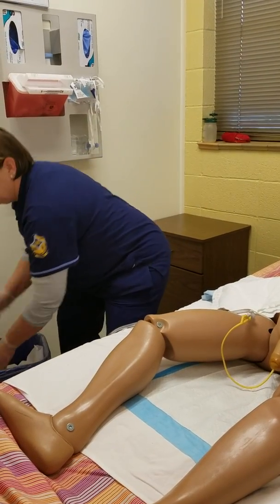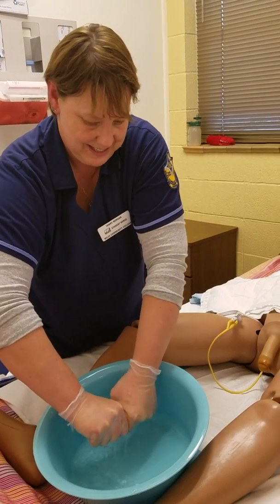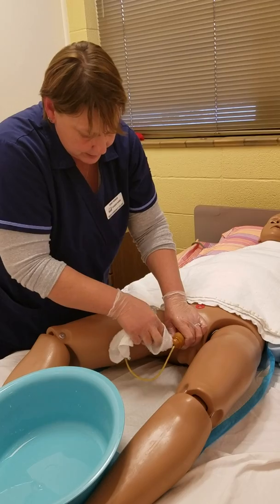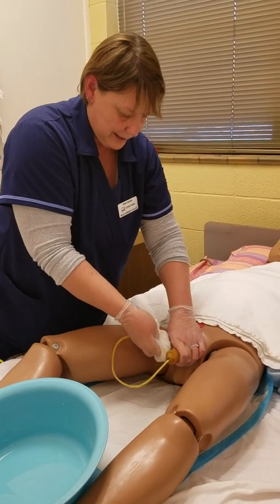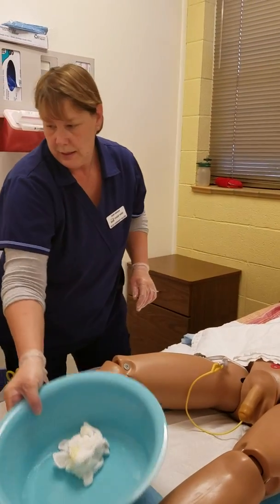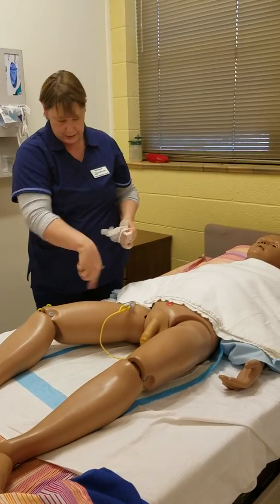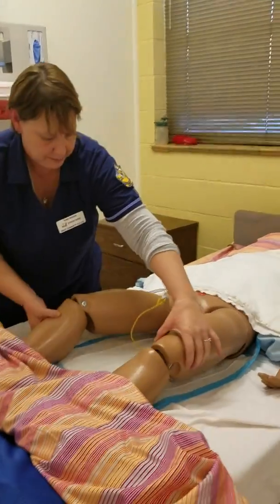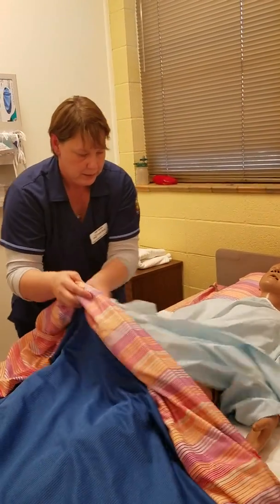I'm going to dispose of all of this in the garbage. I'm going to get my warm soapy water — Jose, you're going to feel me touching you again — and I'm going to clean right around the urethra to get that betadine off, making sure to get him good and clean. Jose, how are you doing? He seems to be doing okay and the catheter is draining well. So I'm going to go ahead and take off my gloves, wash my hands, and get him back into a comfortable position and cover him up.